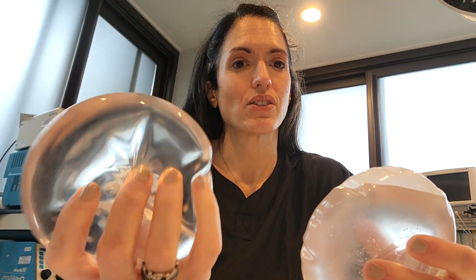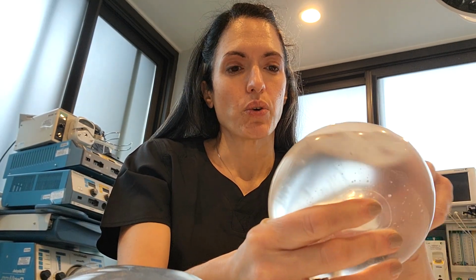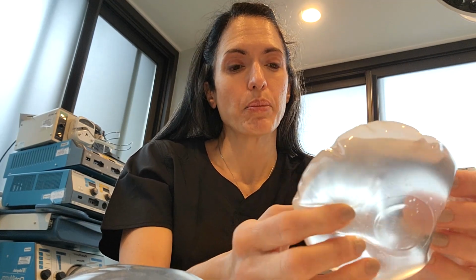So let's talk about the different types of implants. The two main categories are saline and silicone. They have similar shells, but the silicone is filled with soft silicone gel and the saline is filled with salt water. Here I left a little air just so you can see the water level, but normally the air would be removed and it would be just the salt water filling the implant.